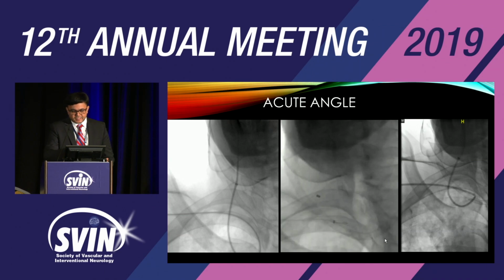And as you can see in the middle picture, as I'm trying to advance my intermediate Navien with a micro wire, it got stuck. It's not moving. Because of this, we took it out, did a small run, and we see there's a kink in there. Because these catheters have a lot of transition zones, and they're supposed to be flexible in the distal part. Otherwise, they're going to cause a lot of dissections. So this is one thing that we have to keep in mind.